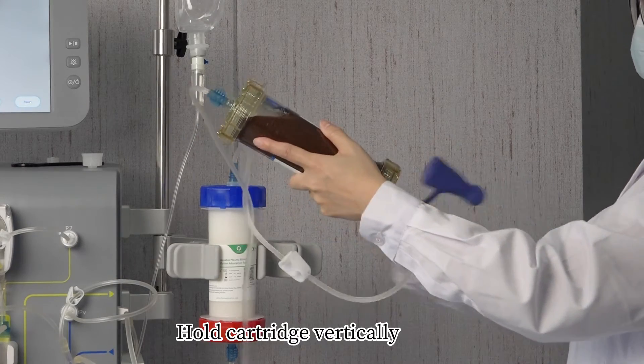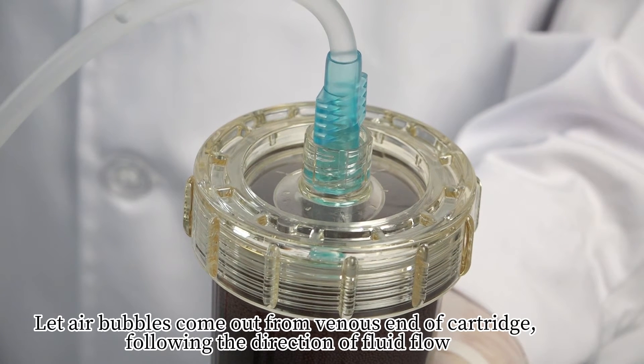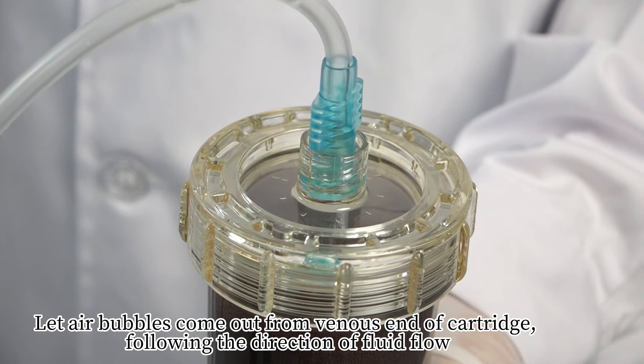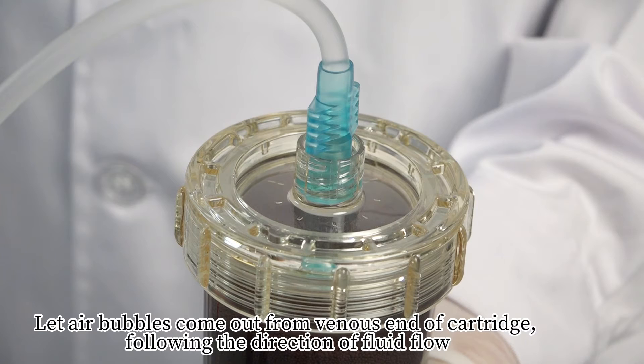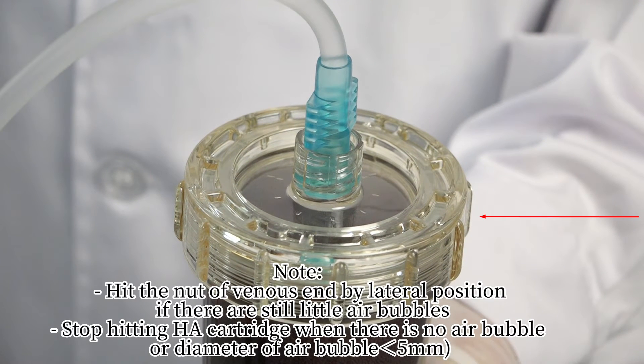Hold the cartridge vertically. Let air bubbles come out from the venous end of the cartridge, following the direction of fluid flow. Hit the knot of the venous end from a lateral position if there are still small air bubbles. Stop hitting the cartridge when there are no air bubbles or the diameter of any remaining air bubble is less than 5 mm.